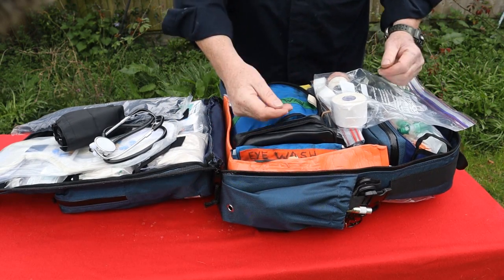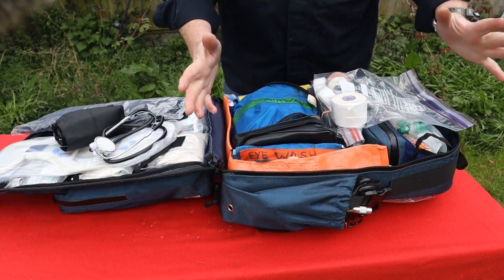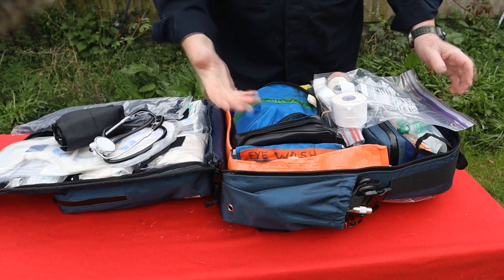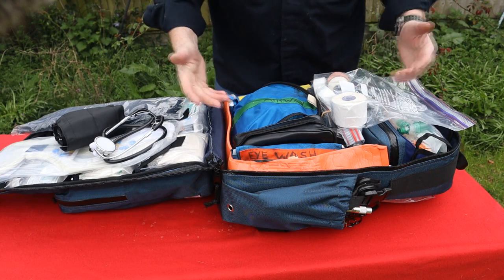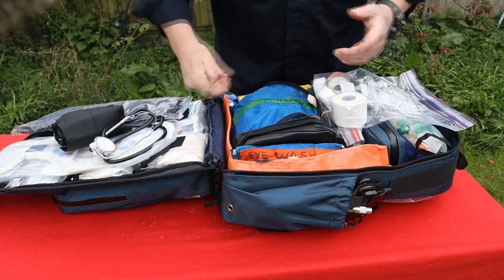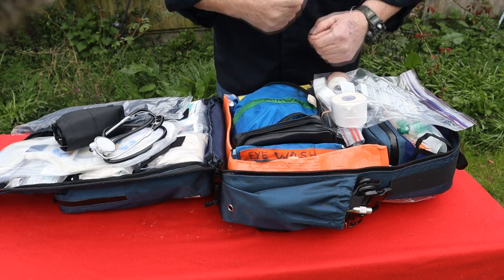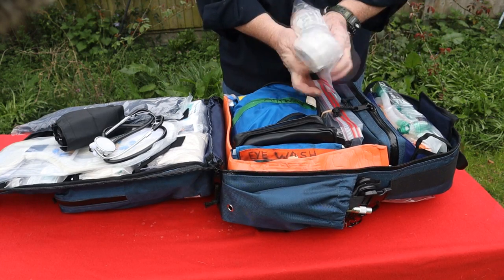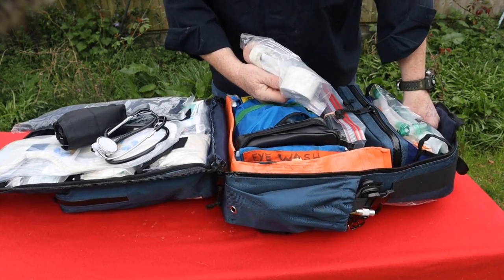If it's a bit of gauze and a bit of tape to hold it in place until the first aider, the ambulance, whatever arrives, then that's all good. If we've got a little bit of time, we can put a dressing on it, we can make it a bit pretty, we can protect it a bit more. So tape. My last thing really is a pair of safety goggles.